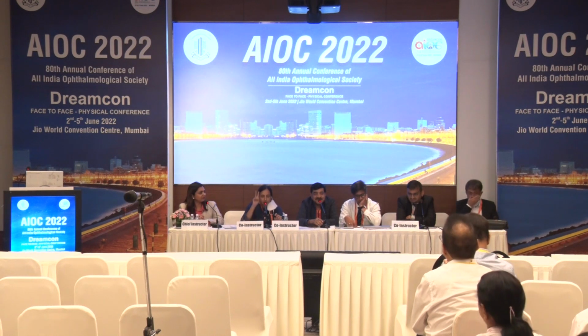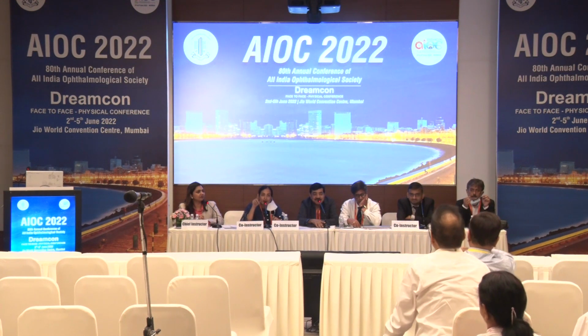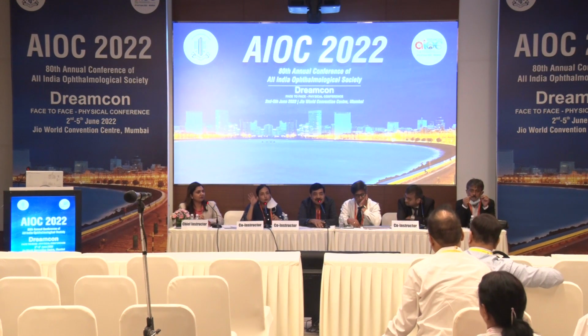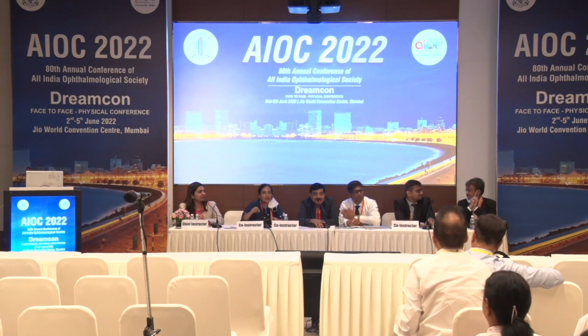So in my mind, there are two things. One, I would like to see all of them on day 1 personally, at least torics and multifocals, because I want to see their general satisfaction level on the slit lamp. Most of us will not dilate and check the axis, as it doesn't work in high volume. But if you have gross astigmatism, you have to do something, but counsel them for at least 2 or 3 sessions before you touch that eye.